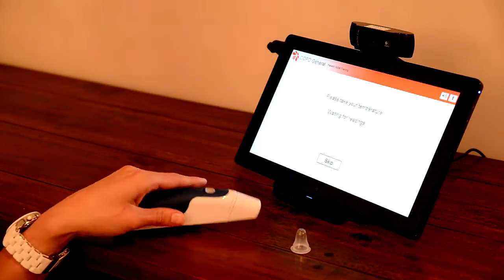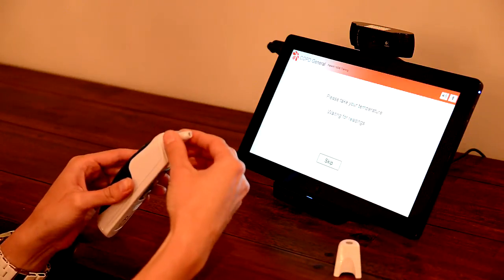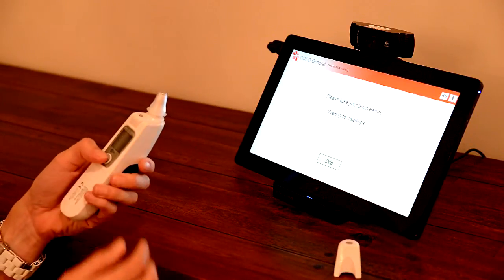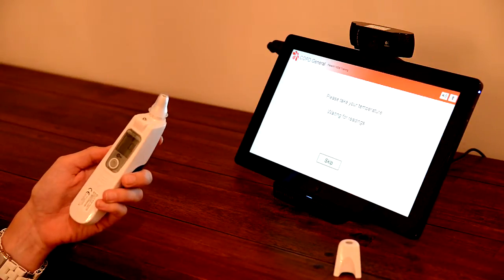To take your ear temperature, first remove the large white probe cover and place a small plastic cap over the probe. Now press the ON button near the display window and wait for the display to show the previous measurement.